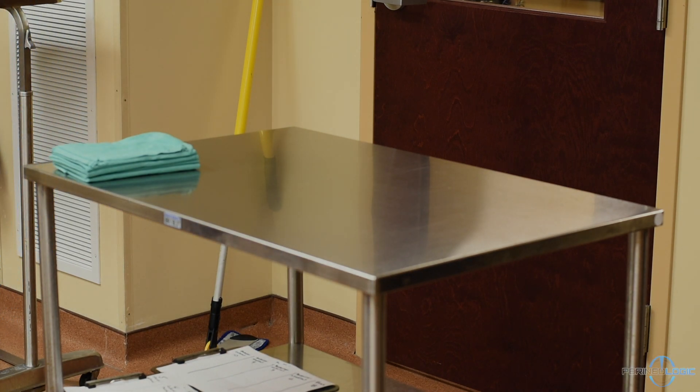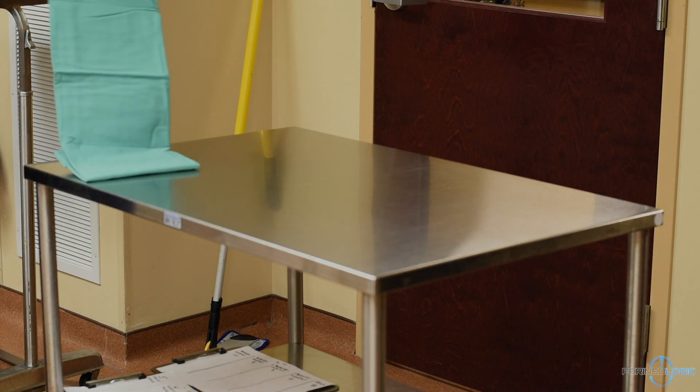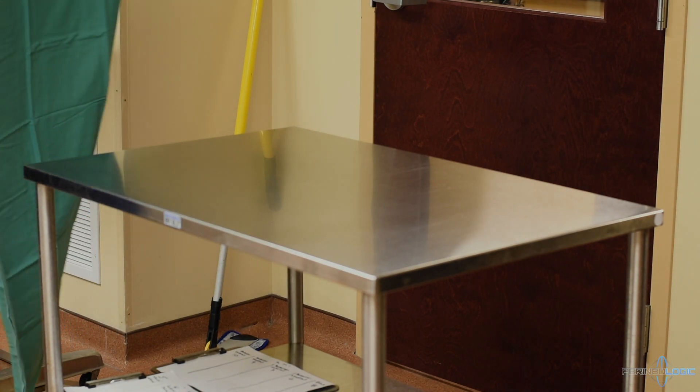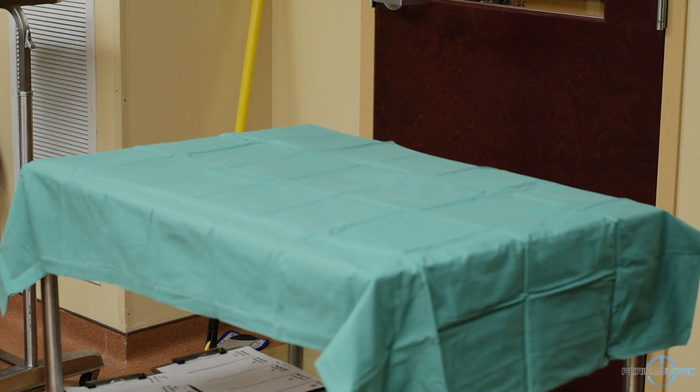Today, we will be setting up the procedure tray for a trans-perineal prostate biopsy using the Precision Point Access System from Perineal Logic. First, we will cover the table with a sterile drape. We will be throwing the necessary instruments and materials out onto the sterile drape before setting it all up.